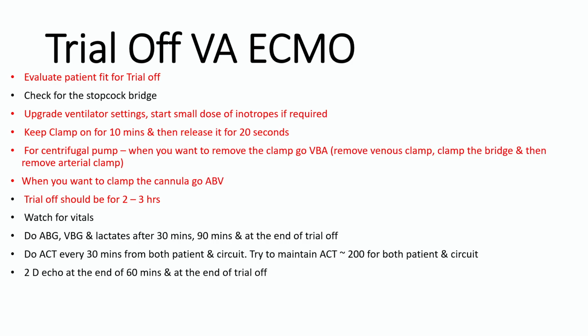And when you increase the load, you have to see how it is behaving. If by increasing the load you start developing MR or your ejection fraction starts coming down, then that is not a good sign, and you have to stop weaning at that time.